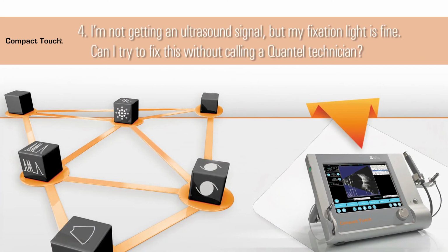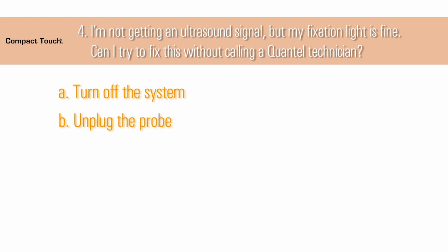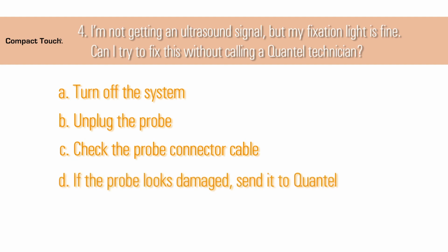4. I'm not getting an ultrasound signal, but my fixation light is fine. Can I try to fix this without calling a Quantel technician? Turn off the system, unplug the probe, and check the probe connector cable to ensure the two pins are straight, not bent, and in good condition. If the probe looks damaged, send it to Quantel.